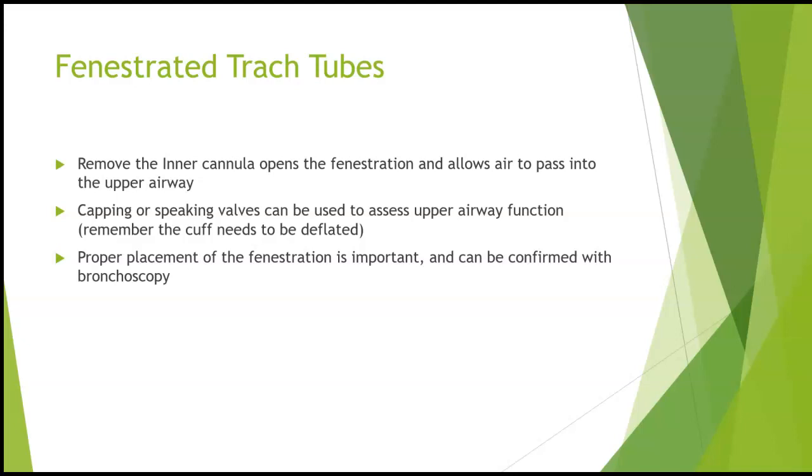We can then take those caps or speaking valves off if we need to suction the patient. And if the patient requires mechanical ventilation again, all we have to do is reinsert that inner cannula, inflate the cuff, and we're back to having a patent artificial airway to use for that.